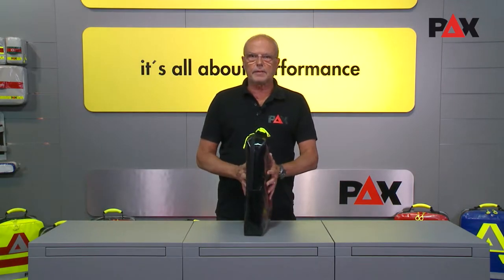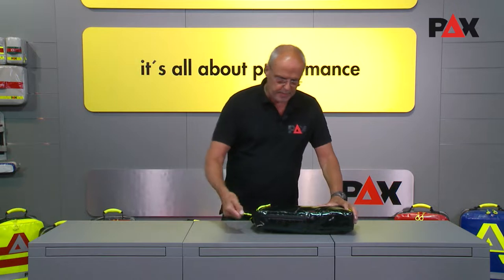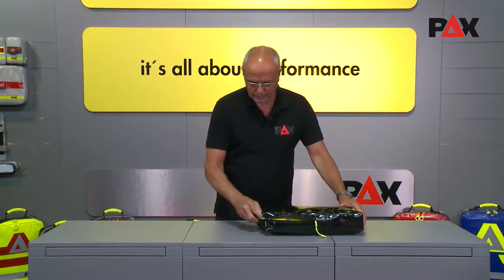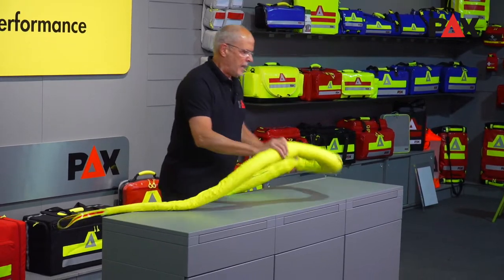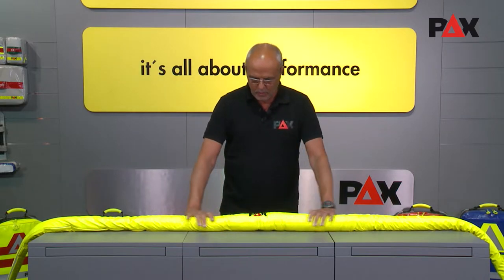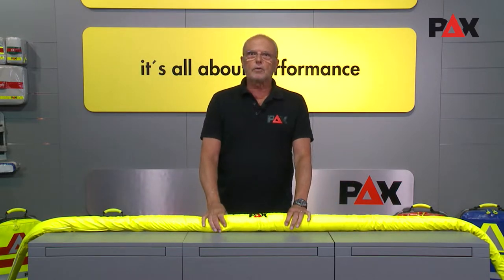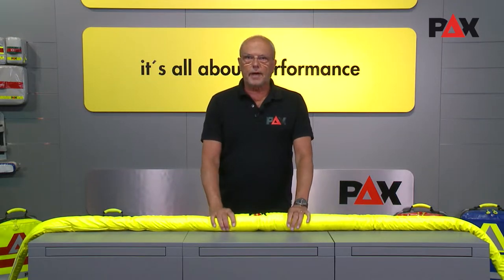The BOA is packed tightly in this wrapping so it doesn't take too much space, and I'm taking it out of the package now. The PECS Rescue BOA has a total length of 3.4 meters and is made for the evacuation of patients from tight spaces, for example from different vehicles.